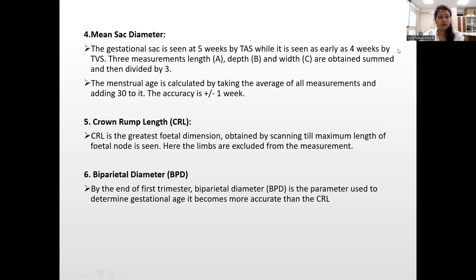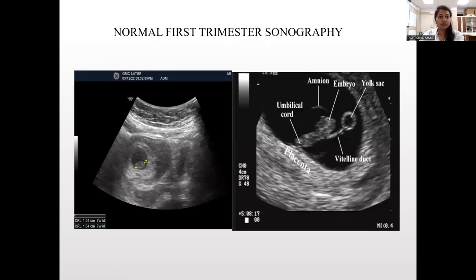CRL, that is crown-rump length, is the greatest fetal dimension obtained by scanning till the maximum length of the fetal pole is seen; limbs are excluded. BPD, biparietal diameter, is the parameter used to determine gestational age and becomes more accurate than CRL. This image shows normal first trimester ultrasonography depicting umbilical cord, amnion, embryo, yolk sac, vitelline duct, and placenta.